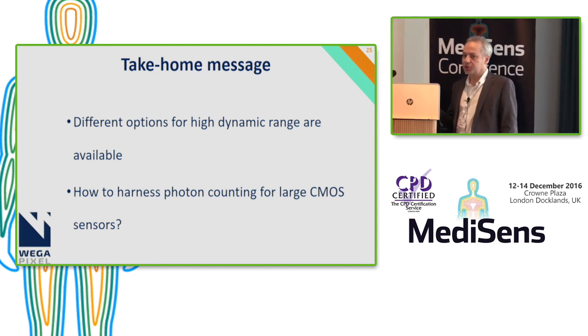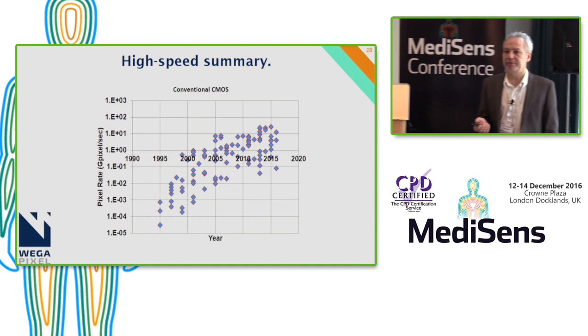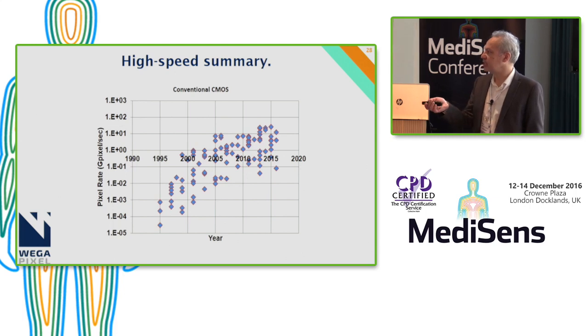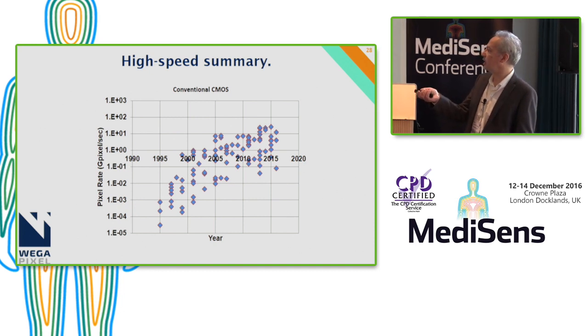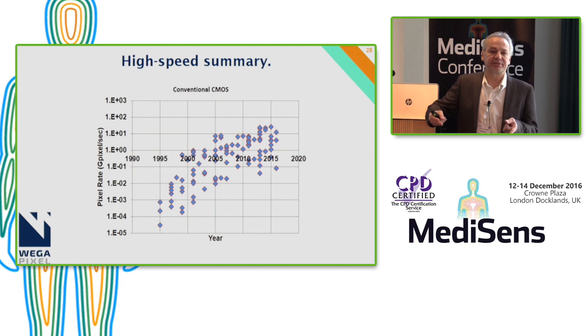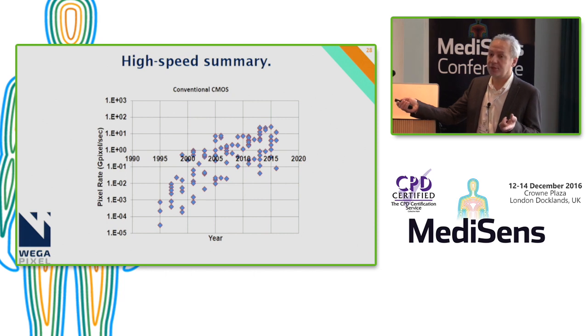And the last point was speed before going to the conclusion, and I will skip the technical bits and just show a couple of plots. This shows the speed of CMOS sensor pixels as a function of the year, and the speed is labeled with a pixel rate. So bear in mind the gigapixel, this is the line for a gigapixel per second, which means you can read a megapixel sensor at 1,000 frames per second. So that's high speed. Nowadays, faster sensors, which are megapixel sensors, go at about 20,000 frames per second.